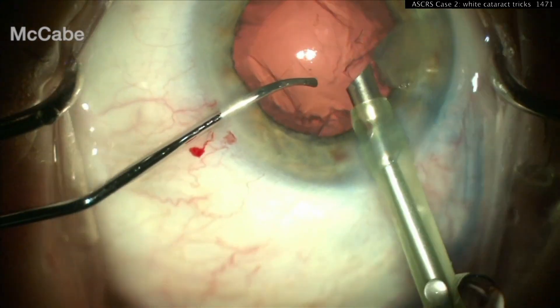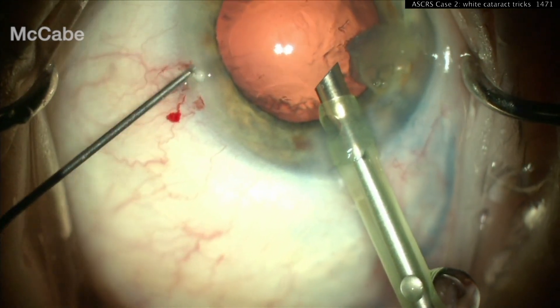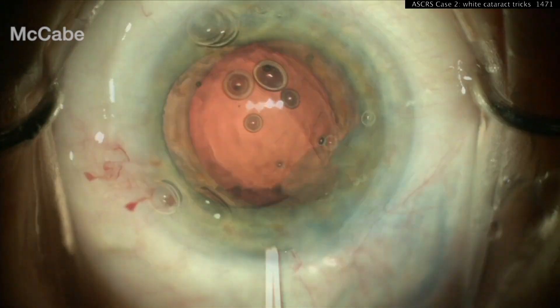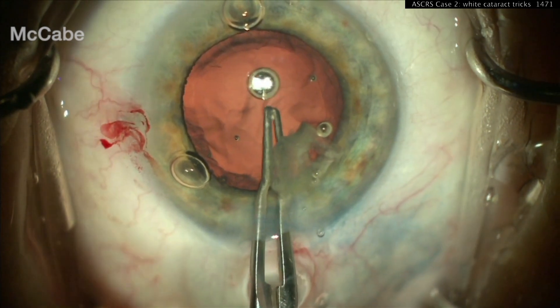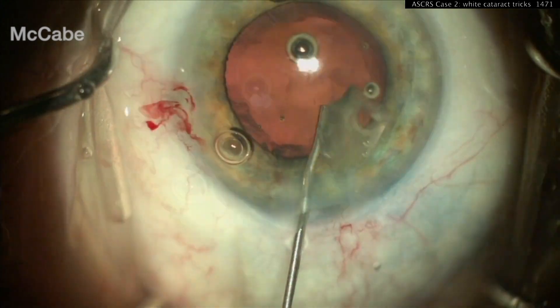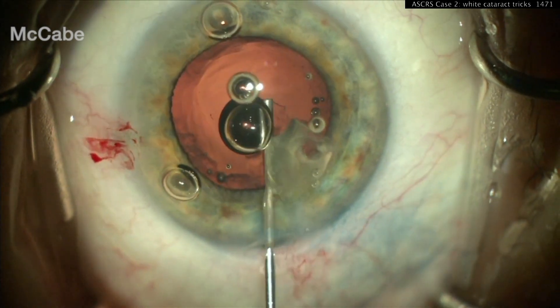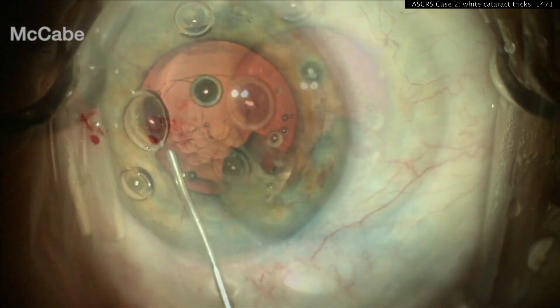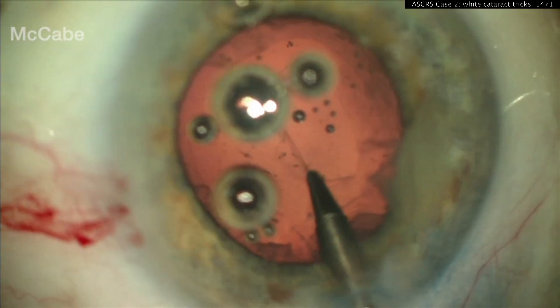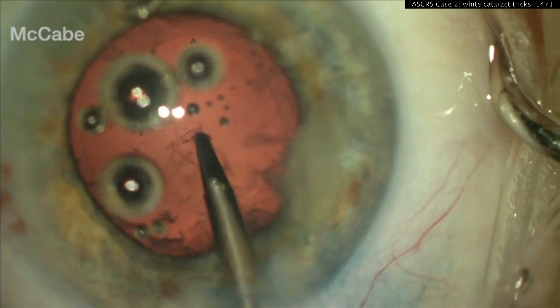What would be ideal? Ideal is going to be this case — you have a broken bag here during phaco, and our guest surgeon Kathy McCabe is doing a great job filling up the viscoelastic and creating a posterior capsulorrhexis. Trying with the regular forceps to get a posterior rhexis is not so easy sometimes. A couple of hints: inject some viscoelastic behind the posterior capsular rupture on top of the anterior hyaloid face, move that last piece of nucleus out of the way, and using these specialized forceps, she's able to get a round posterior capsulorrhexis.